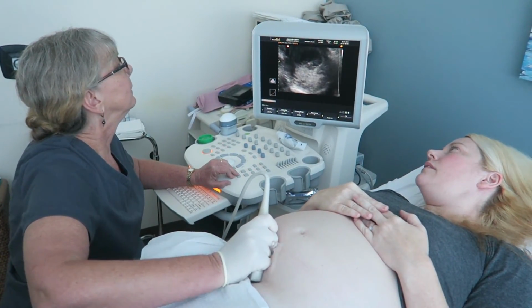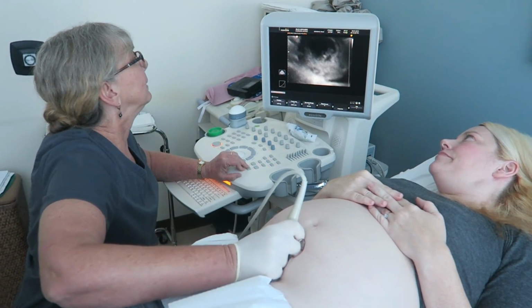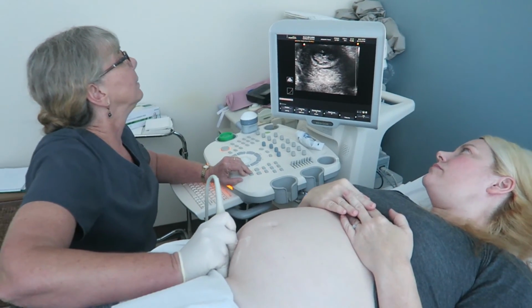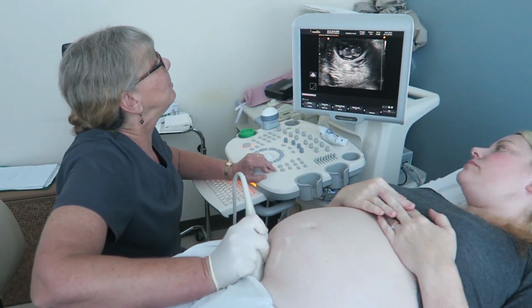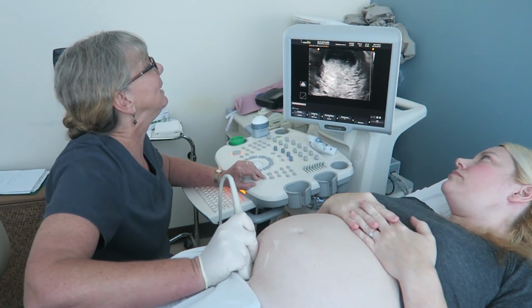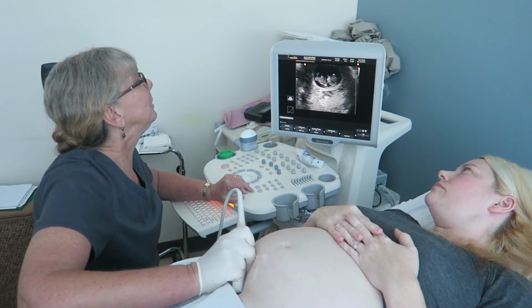11, okay. I'm going to push on you, okay? Okay. At what, when would the gender be? Depends what kind of test you have, but with ultrasound, the way we determine gender is look between the legs. Real scientific. Yeah. So that's usually about 16 weeks.